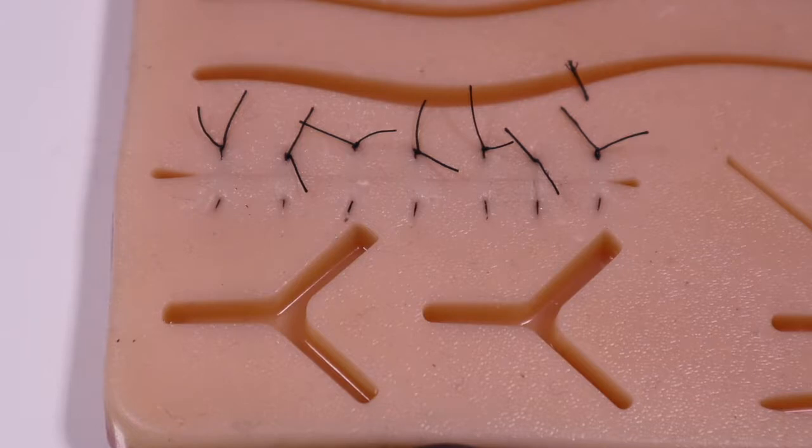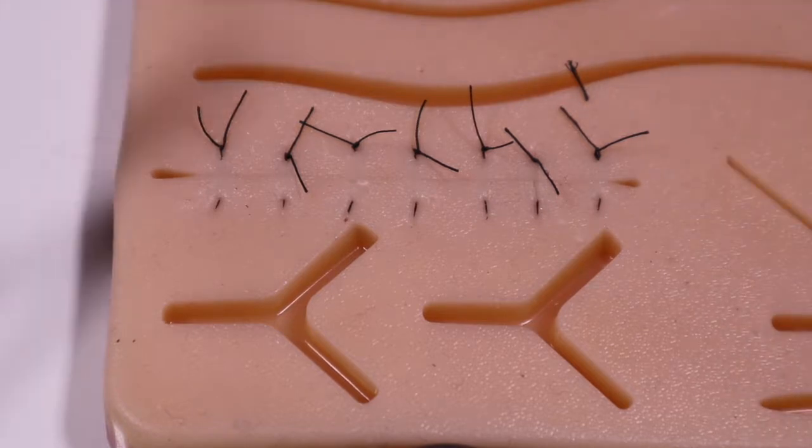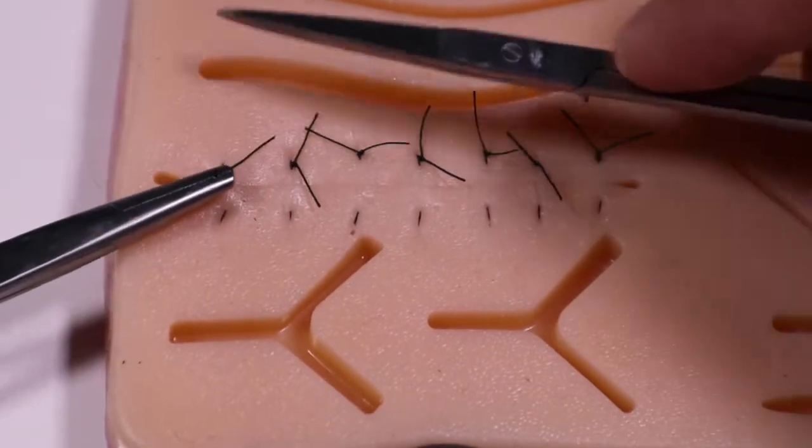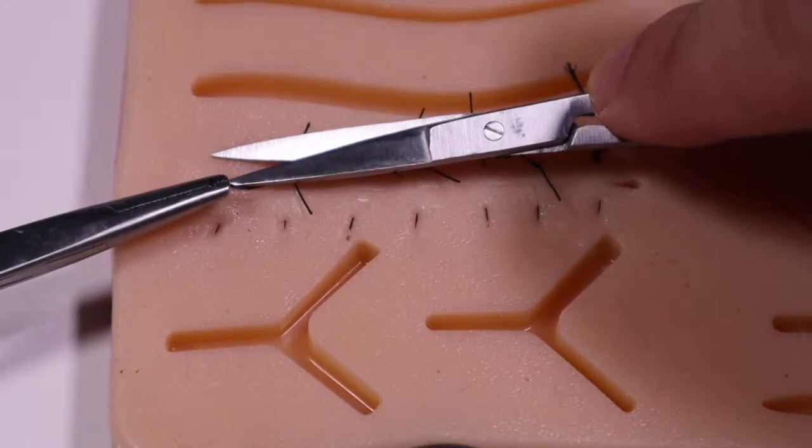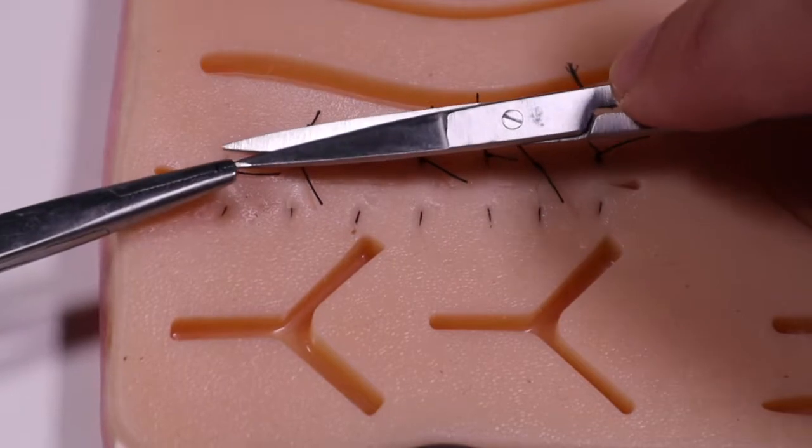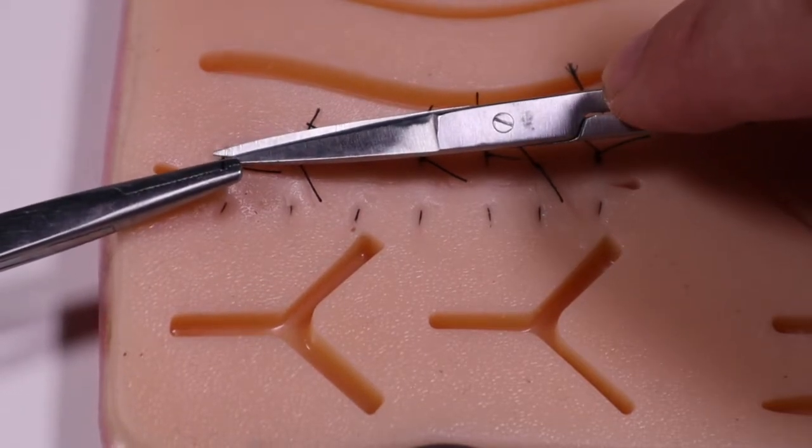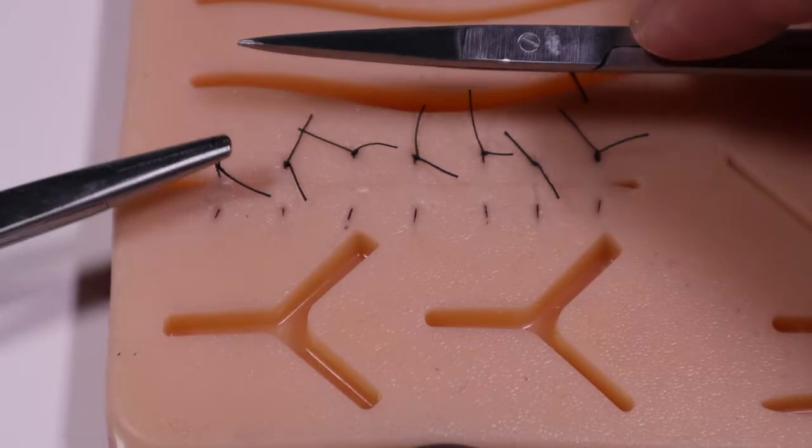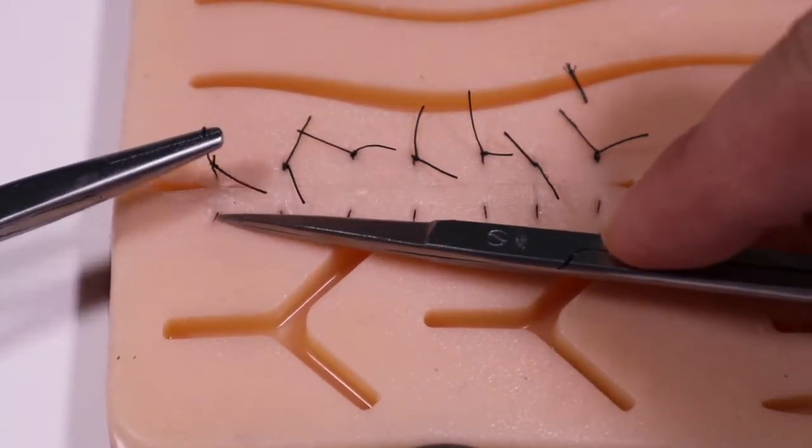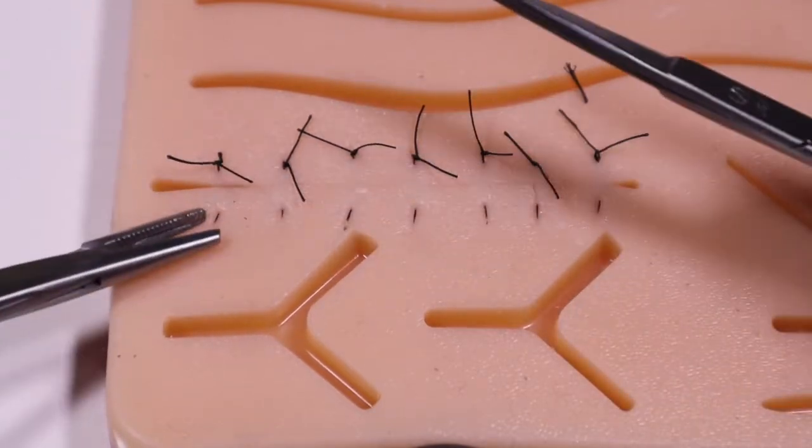So now how do we properly remove the vertical mattress suture? Again, we want to follow the same principles of every other suture removal in that we don't drag any exposed suture through the skin wound. So we will cut our far suture right at the skin.